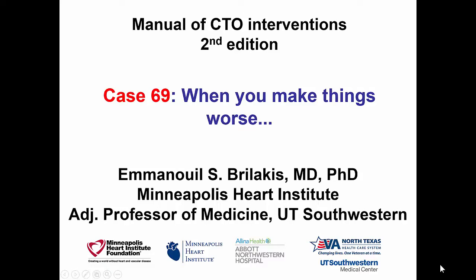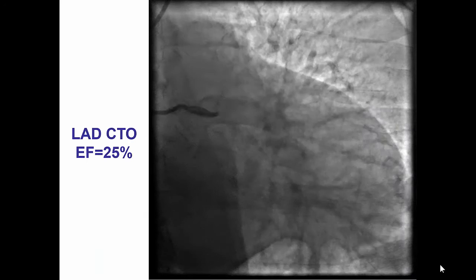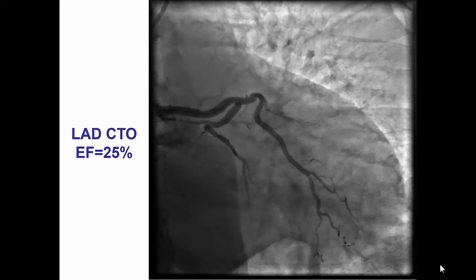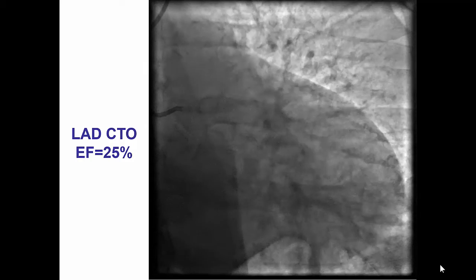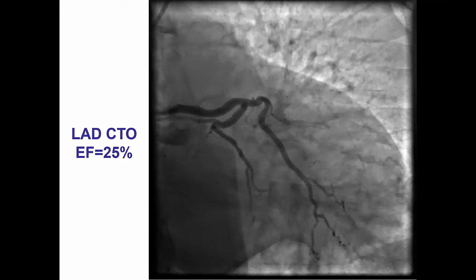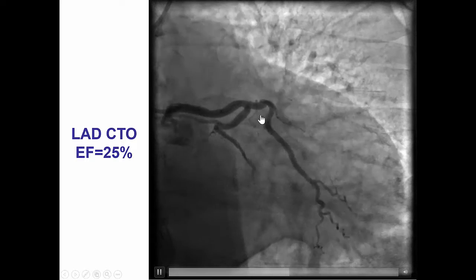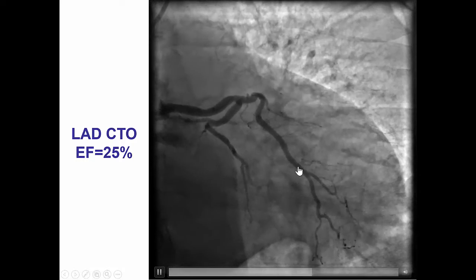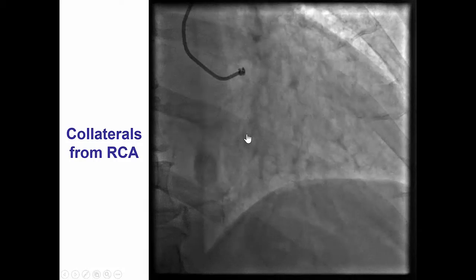Hi, this is Manos Brilakis from the Minneapolis Heart Institute, presenting case 69 for the second edition of the Manual of CTO Interventions. This is a case demonstrating a potential complication of CTO PCI. The patient presented with cardiomyopathy and was referred for diagnostic angiography that showed single-vessel disease with ostial occlusion of the left anterior descending artery. There was no significant disease in the circumflex, giving a large obtuse marginal branch and a smaller distal circumflex.